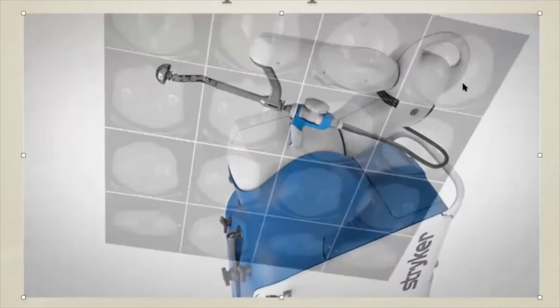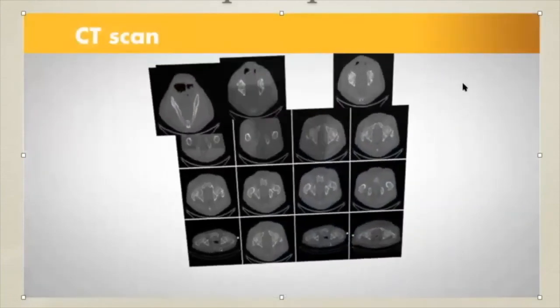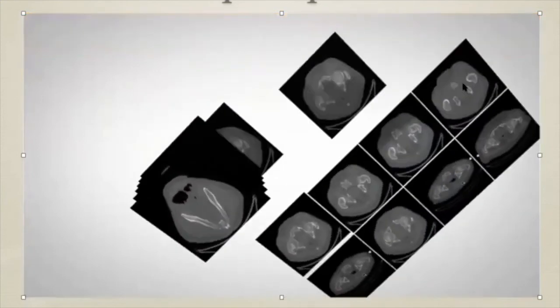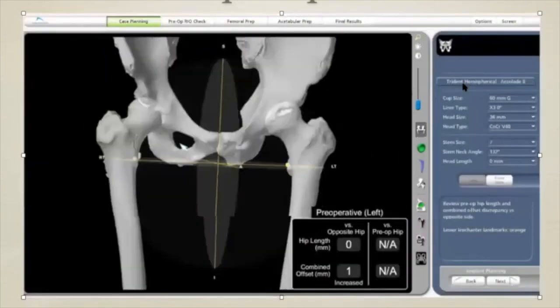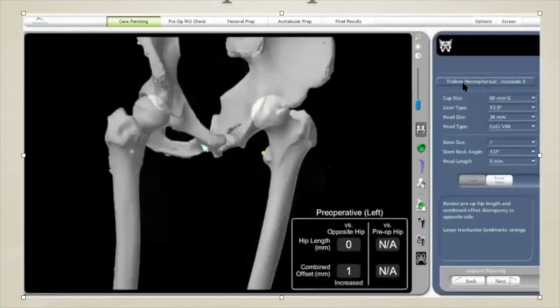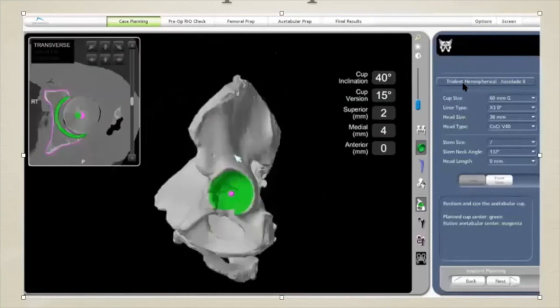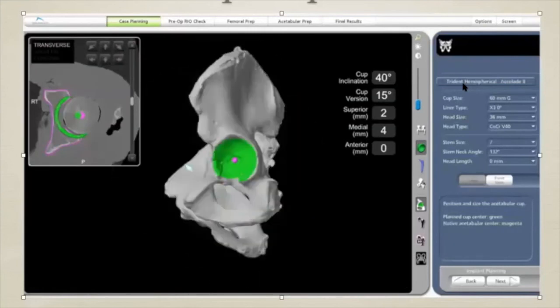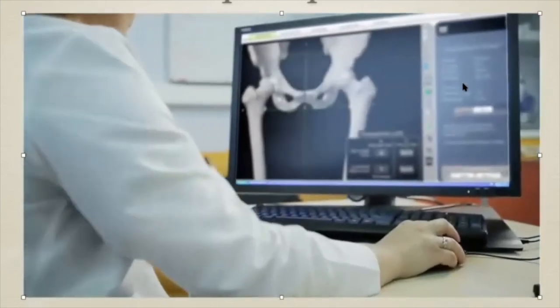And what it has on it is that drill reamer on the right side, and then it has the reamer handle on the left. So we start by first taking a CAT scan of the patient's body or pelvis, and we build a three-dimensional model of the patient's hip. Once we have that three-dimensional model, we can now import that data in a 3D form onto the screen and take all the appropriate measurements that we need. We can take all the appropriate views and view in a 3D form that particular patient's anatomy.